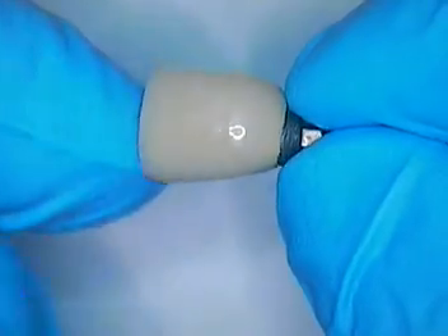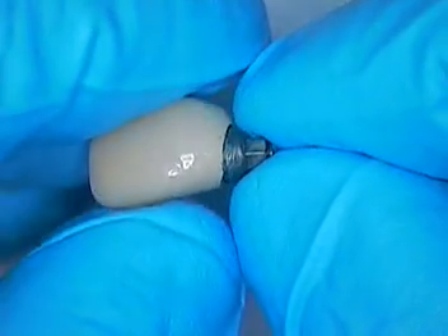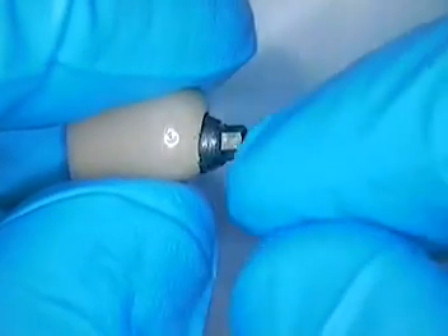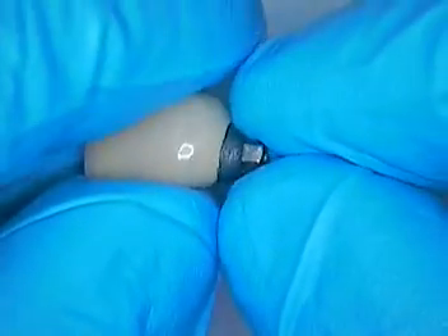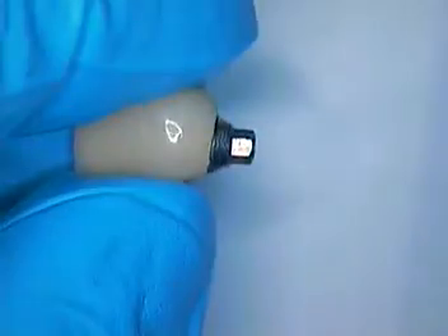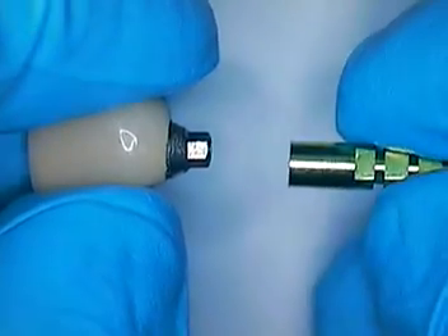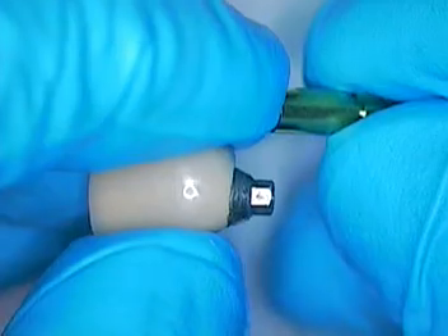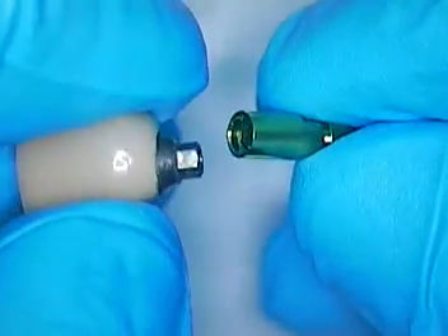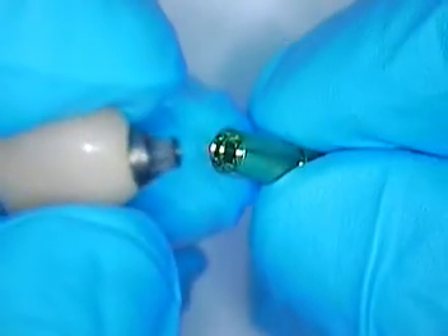This crown actually has a metal lingual. It has the abutment attached to it. It is a hex configuration to the abutment, so that will be internally a hex configuration in the implant. It is a Core Vent type of implant that was placed early on in the 90s, I would say. Zimmer has since taken over this company — Zimmer Dental.